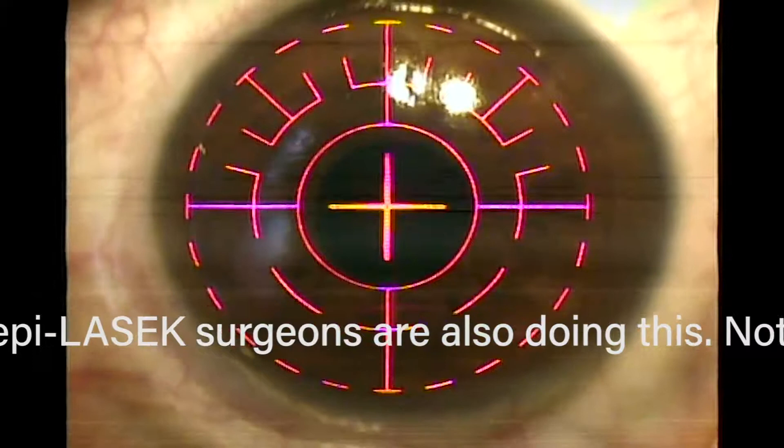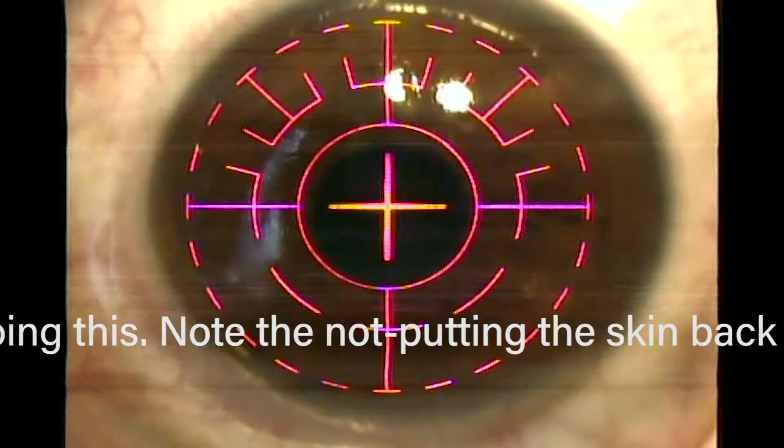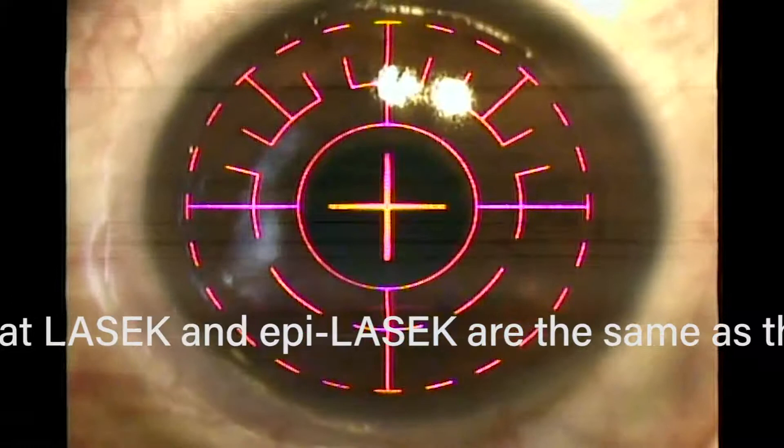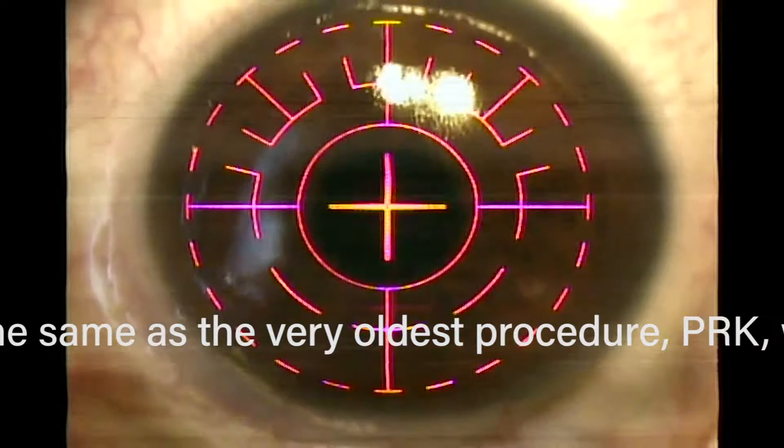I'm centering the eye and turning on the iris registration, which captures the iris landmarks, and now the laser is going off. You can see the ultraviolet light. From the patient's point of view, it looks like a blue light — similar to a bug light but at a slightly higher frequency. You also hear a little bit of noise. This is the laser taking off the prescription in real time.